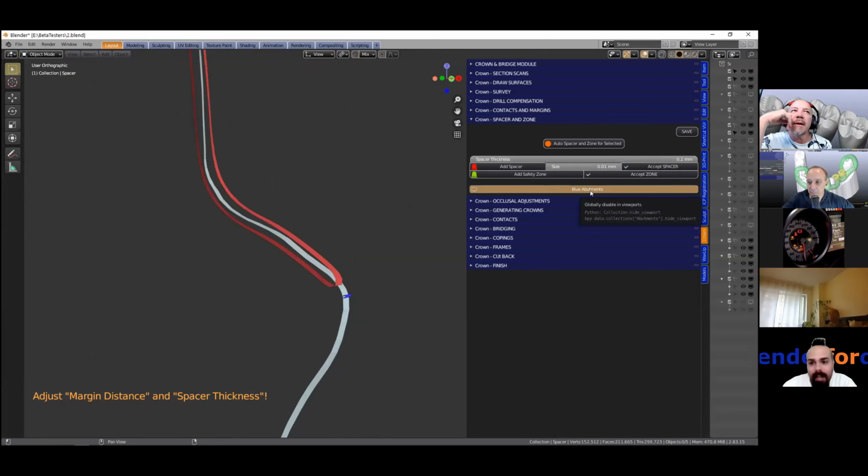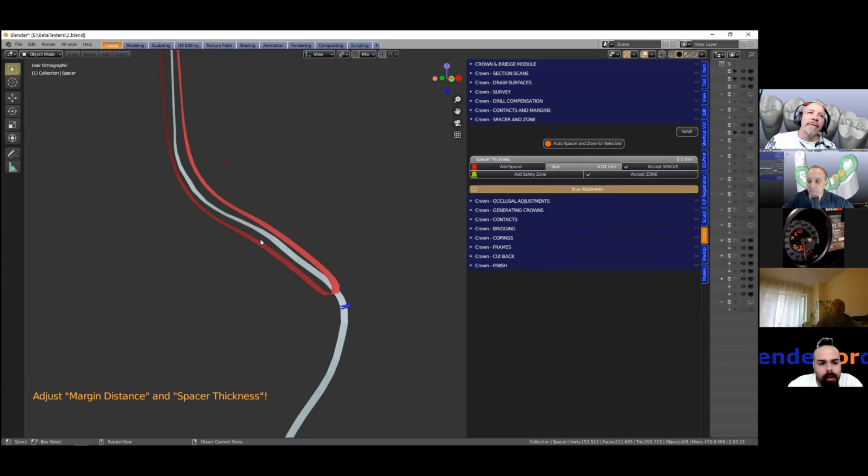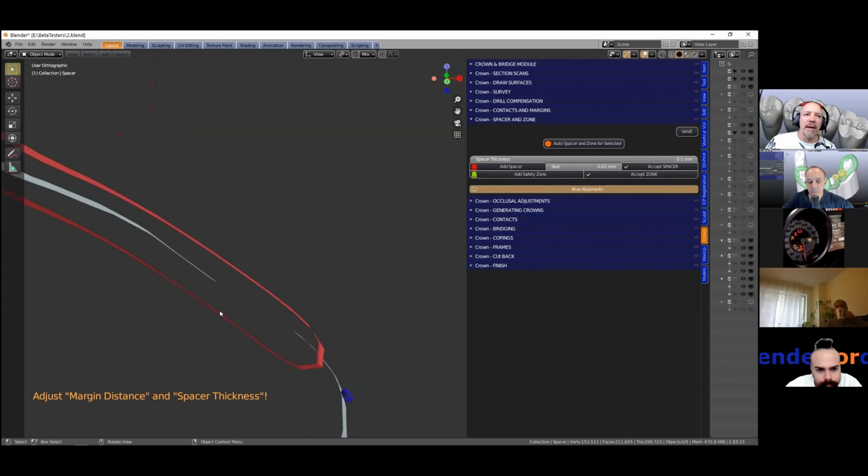You were saying another thing. You mentioned that between the margin and the blue abutment itself there is 100 microns. Is that correct? Well, it's 100 microns inside and outside. So this is now 50 microns. If I take a measure, it's 100 microns from here to there.